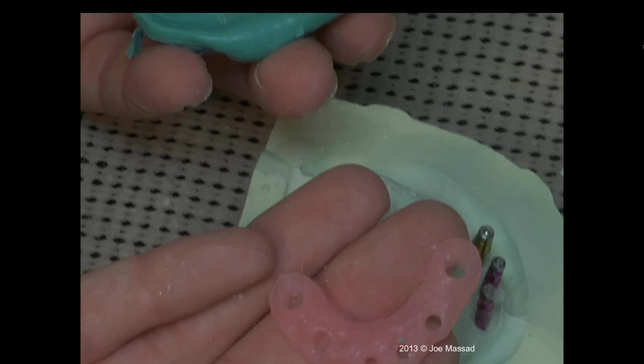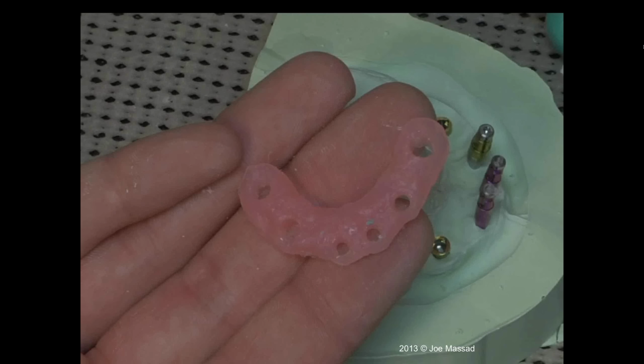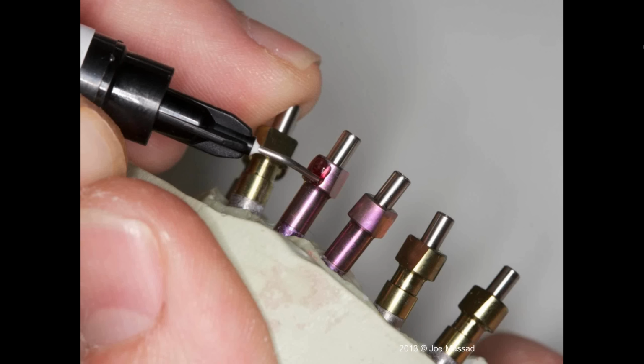So we're now using the open tray impression copings because they're easiest to use. Now, it depends on what manufacturer you're using this with, because some manufacturers, you can't use their impression copings. So you'll have to use a non-engaging type of coping in order to make a verification. Verification jigs are not easy to make in the mouth, and there's not that many materials approved by FDA that you can cure in the mouth that have that much accuracy.